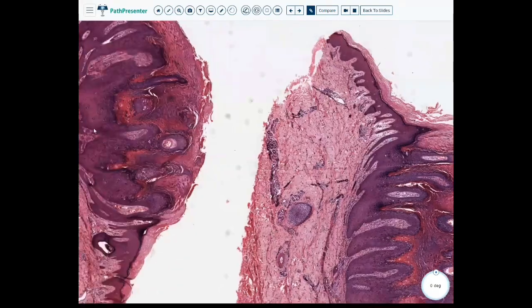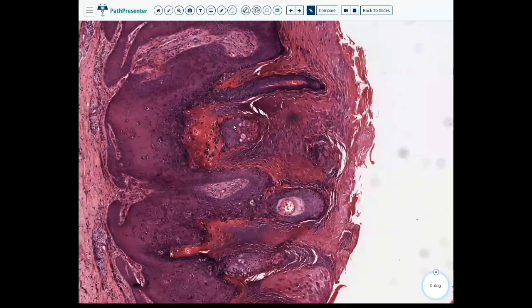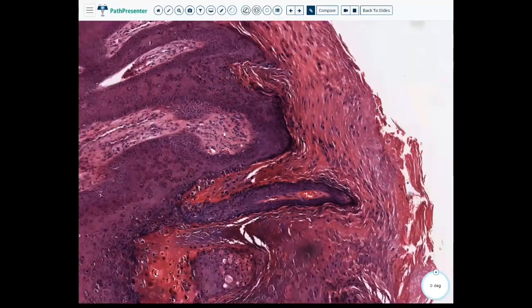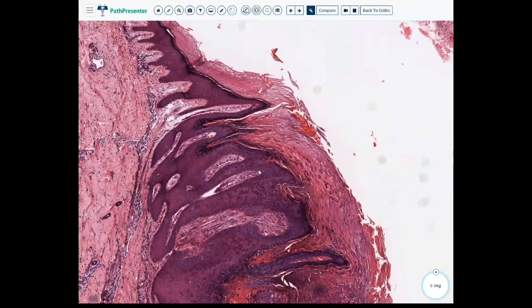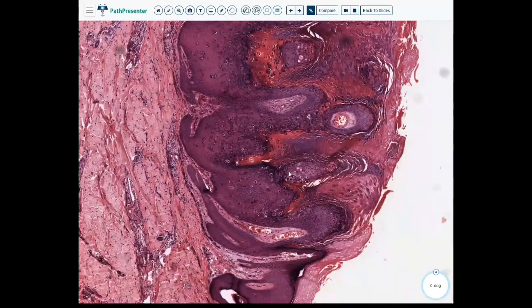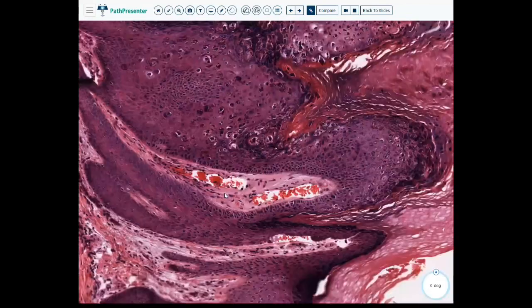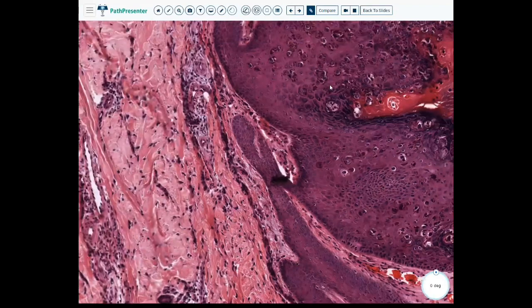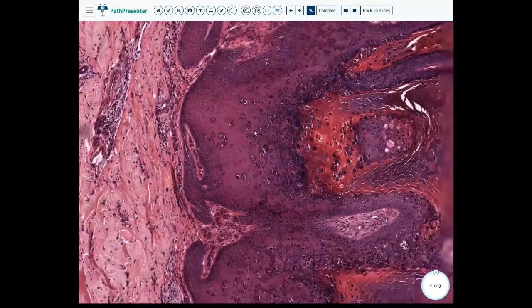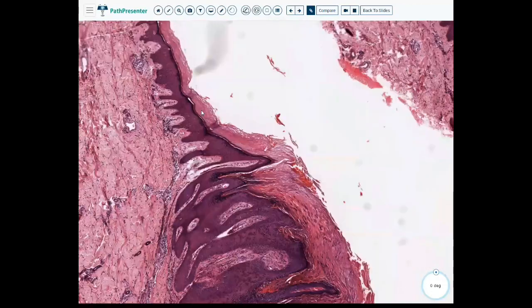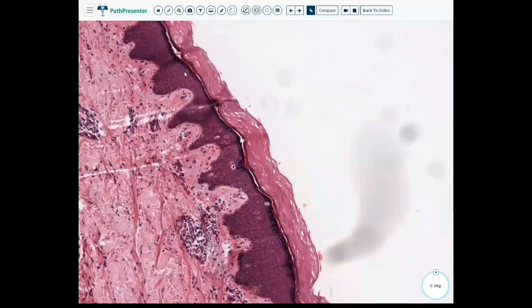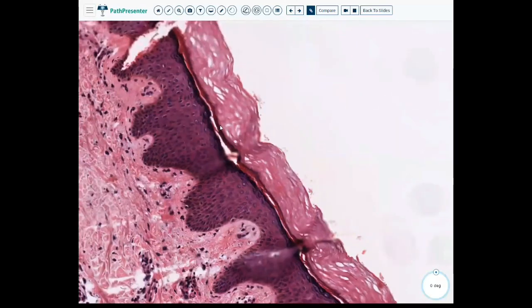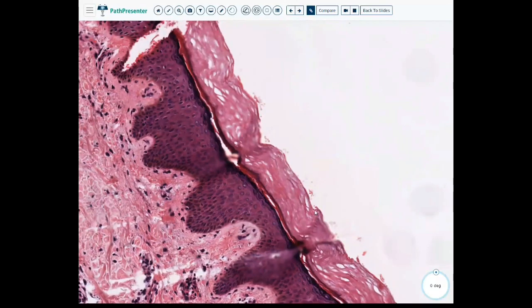There's a little bit of hemorrhage but it's on the surface, and remember the characteristic finding is intracorneal. Here we have nicely dilated vessels within the dermal papillae — these finger-like projections going up, filled with red cells. This again is a classic Verruca vulgaris. These areas have a little bit of acanthosis, but this is orthokeratosis — you see that basket weave pattern of the keratin.